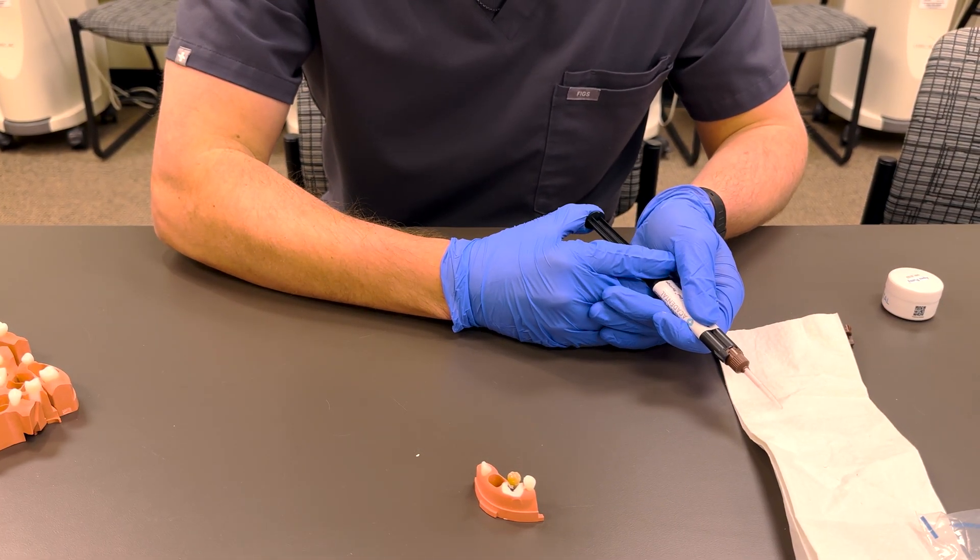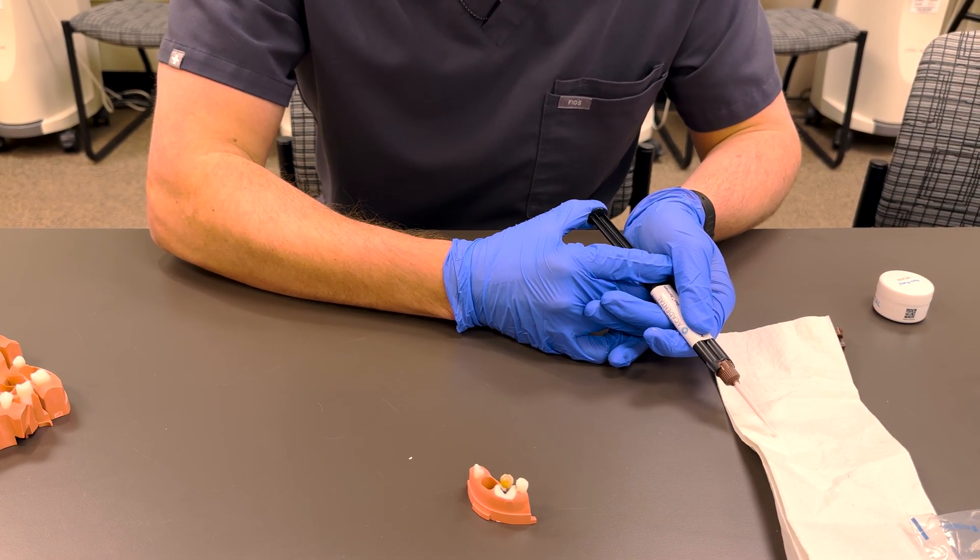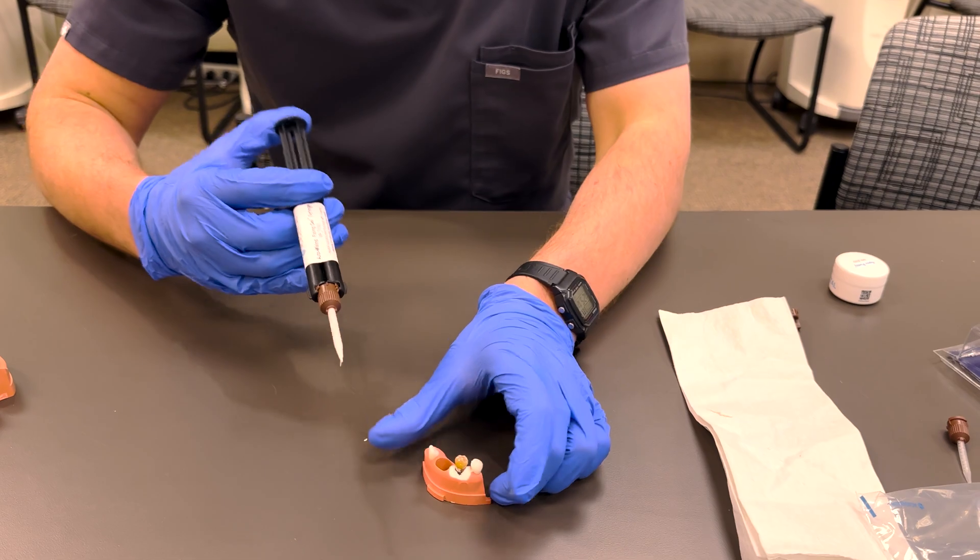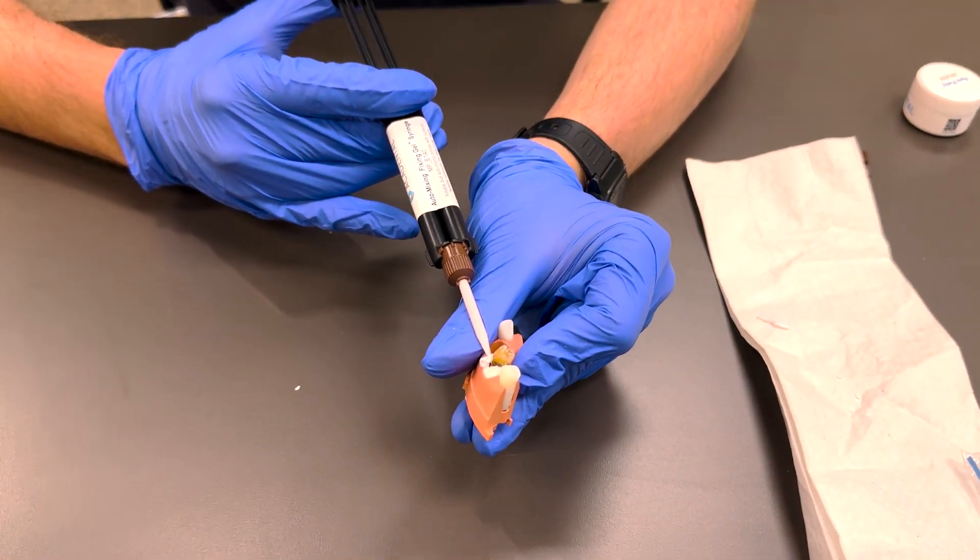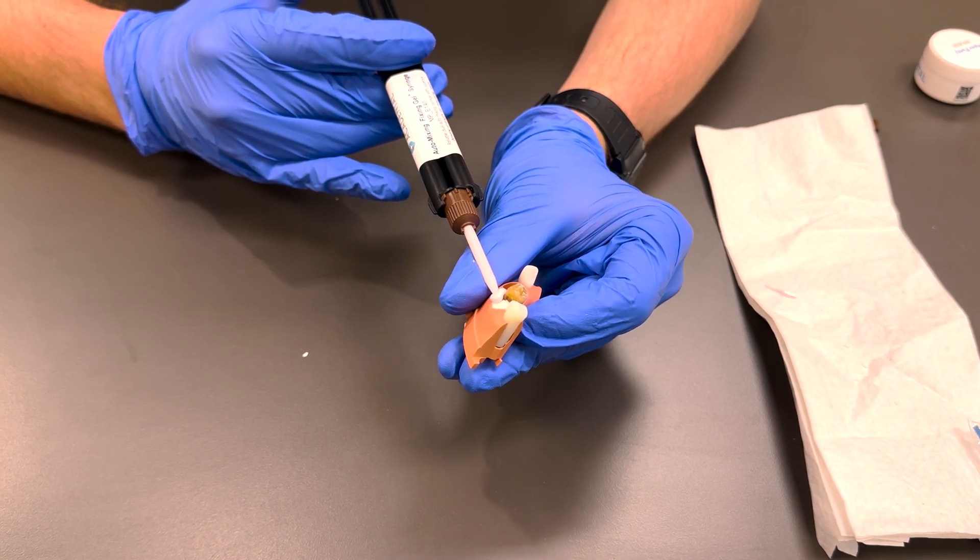You're just going to extrude a little bit like you normally would. It comes out as this pink material. Make sure it's all mixed, and then you're going to put a small layer over the top of the apex putty.